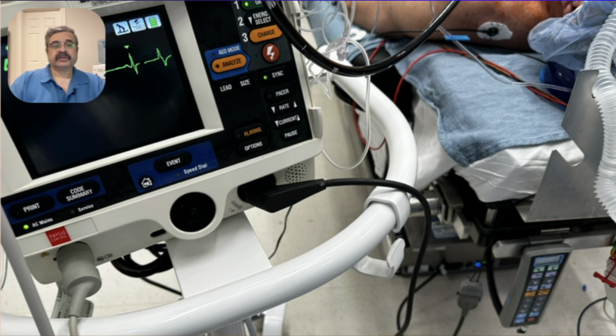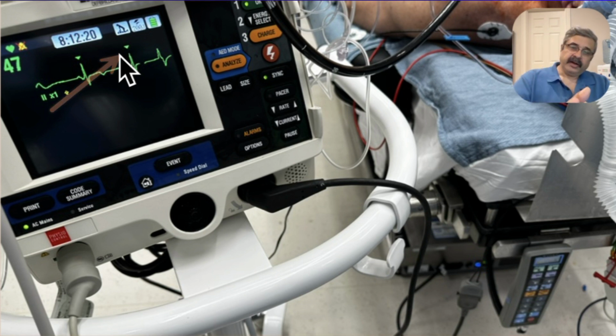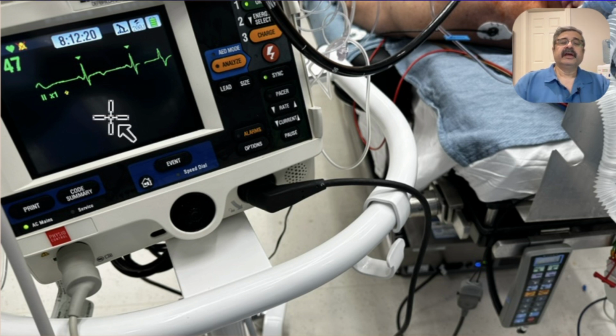This is what it looks like: there is not only the EKG signal being displayed on the screen, but there are also inverted triangles on the R waves, and that's when the patient signal has been brought into the system, either via direct skin leads or the phono slave cable that we use by default in our operating rooms, connected to this specific location on the LifePak monitor.